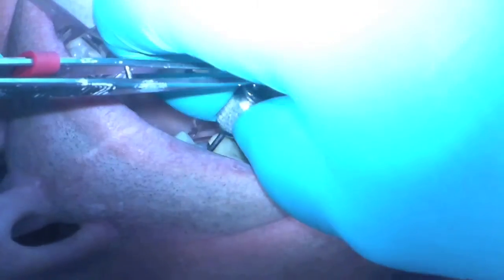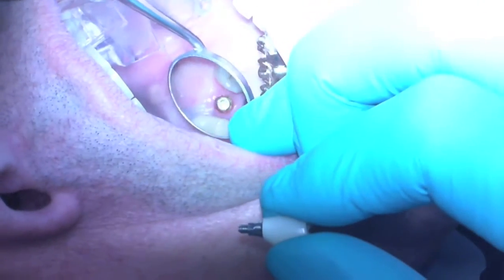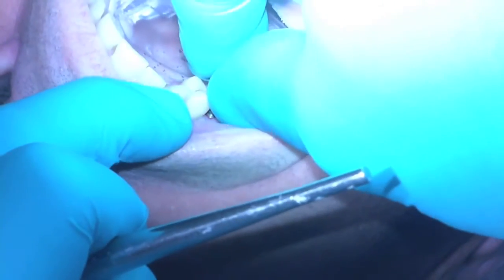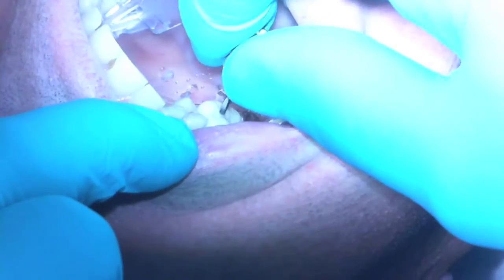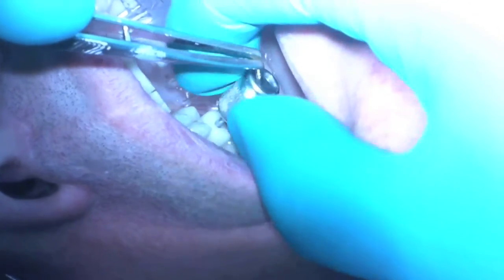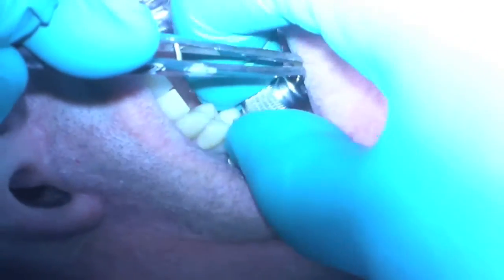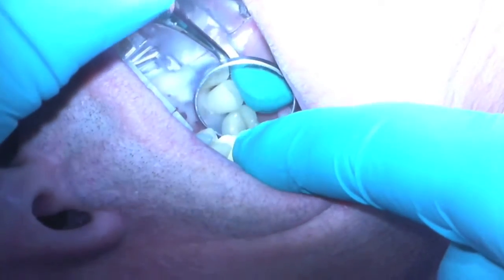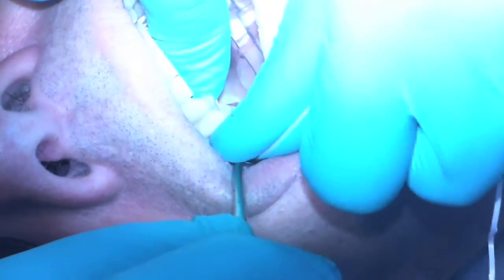So I remove my healing abutment, and I'm placing my screw-retained crown. Again, I'm a CEREC mentor, so this is a CEREC crown. It has a Ti base in there. I'm a fan of it because I get to have full control of everything here. I can choose how much pressure it's going to have on the tissue. It's ideal when you have the implant positioned so that the screw comes right out the middle of the crown, and the implant itself is angled parallel with adjacent teeth, and I'll show you more about that.